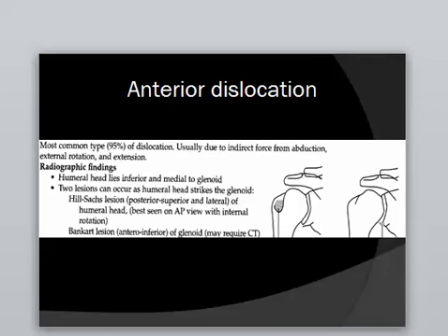Of course, anterior dislocation, you have the anteroinferior lesion of labral tear and Bankart, and you have the Hill-Sachs deformity here. Osseous Bankart means avulsion of the glenoid rim, and Hill-Sachs of the humerus. Any of them, either this one or that one or both, are sequelae of anterior dislocation plus the anterior labral tear.